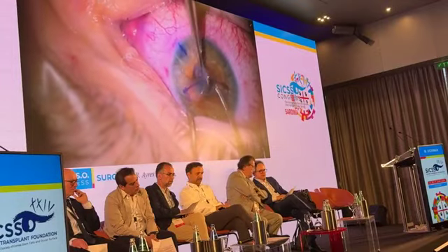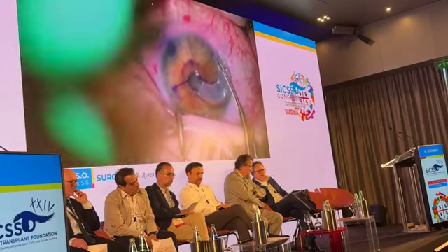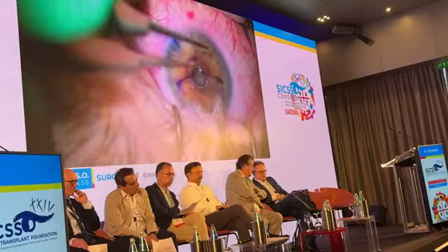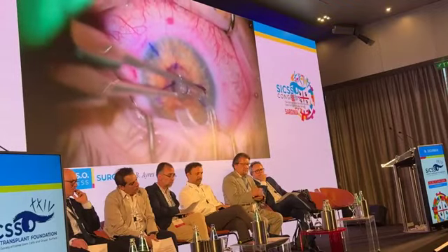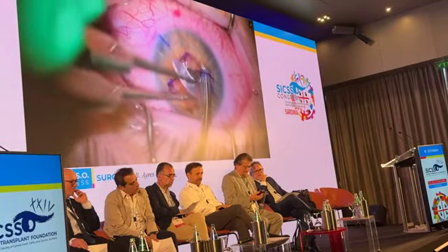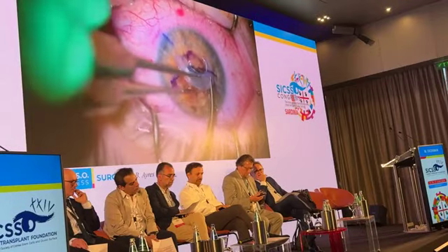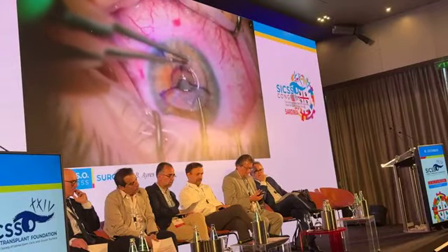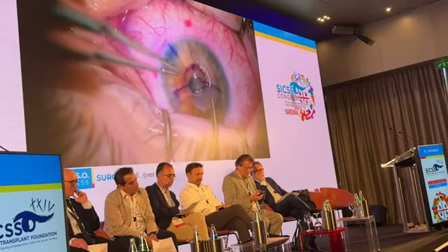And I like to grab a good section of the segment with this insertion forceps, something like that. Because for the first clock hour or two, this is going to want to squirt itself back out of the eye. Let me just make sure I stay centered. Yeah, under a little pressure for just a minute. Let's introduce the segment. Then I'm going to hold it with the tire so it doesn't back out. And then we'll push a little bit more. And then a little bit more. From here on out, this should go almost on autopilot through the channel.